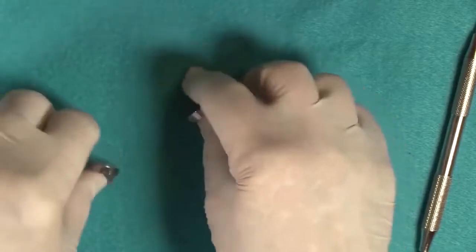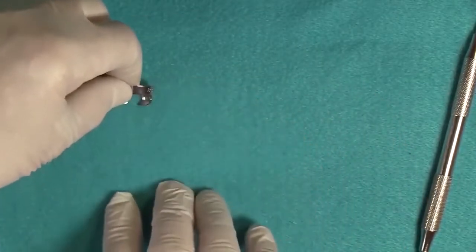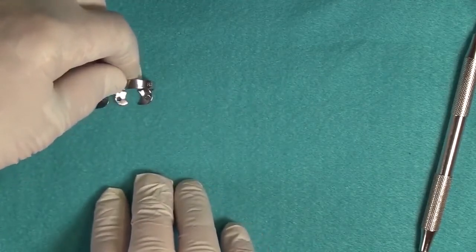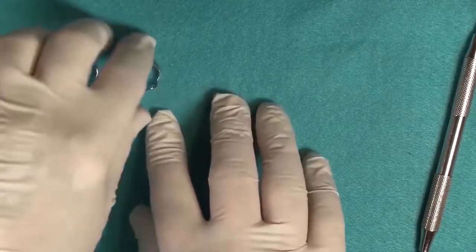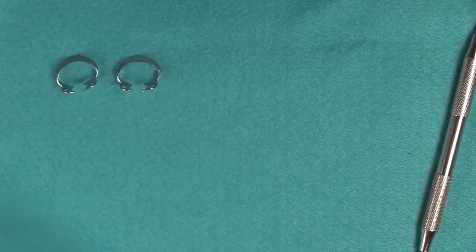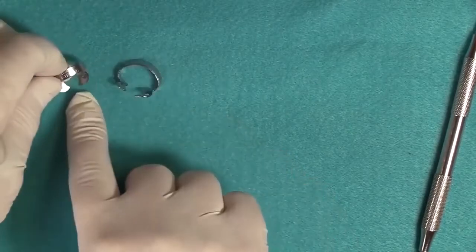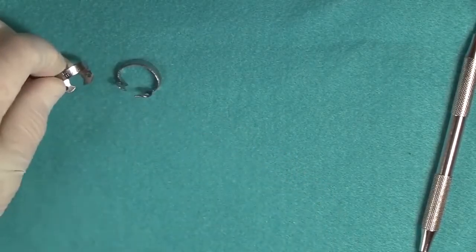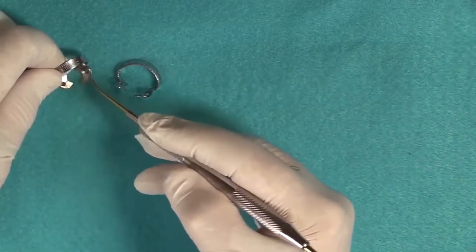Now these also have offset jaws, if you notice. What's unique about the Brinker series is the fact that these are also used for when you have a class 5 subgingival on the buccal or lingual of a molar. I know these are small. These kind of don't quite follow the pattern exactly when you're selecting the clamp, because as you notice, the jaw over here is much smaller.